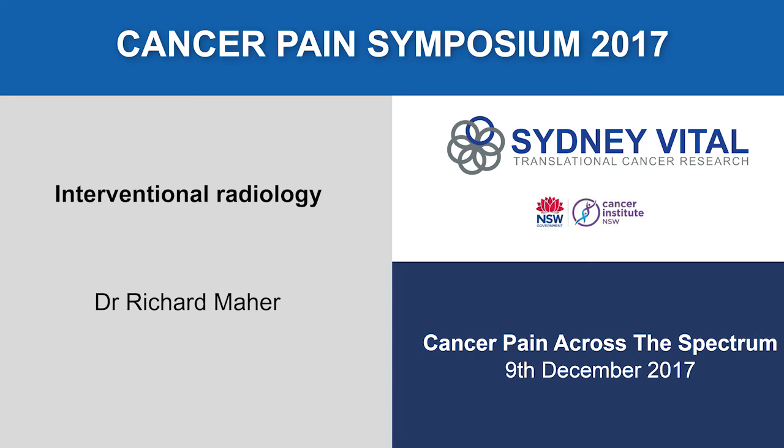So this is a CT here, and this is an MR. The MR shows all the edema and swelling, and actually that line there is the dura. This is nice here on the CT because the white, which is cortex, is now eroded there. So if you go on and inject cement into this vertebral body, there's nothing stopping the tumour being pushed backwards, okay, and then compressing your spinal canal or spinal cord.